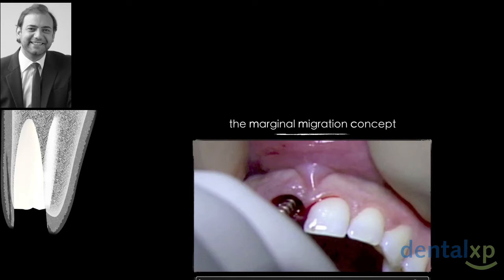The reason I'm using this big and long device, which is 10, 15 centimeters long and straight, is because it's easier for me to see the direction of my implant. So, in my opinion and in my experience, 90% of the failures in the aesthetic zone are not because we didn't do any complicated periodontal procedure, it's just because the implant is in the wrong position.